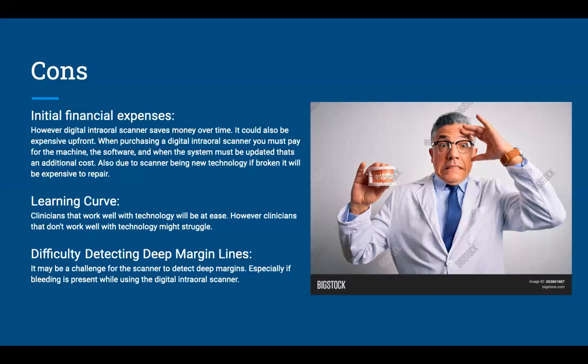When the doctor is doing restorative work, for example crown prepping, the patient may easily bleed, and that bleeding will hinder the intraoral scanner from capturing the necessary structures in order to have a properly fitted crown.